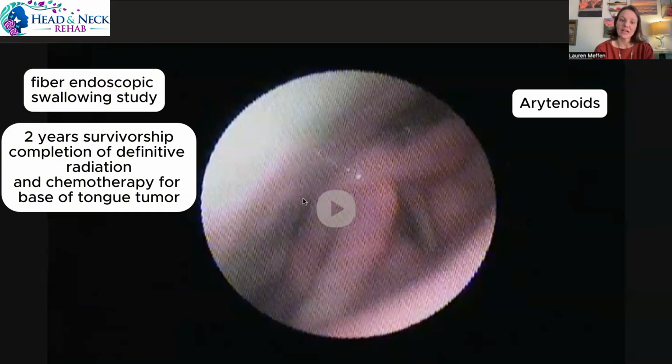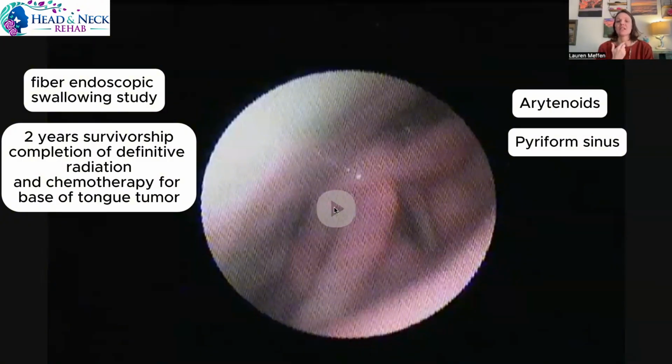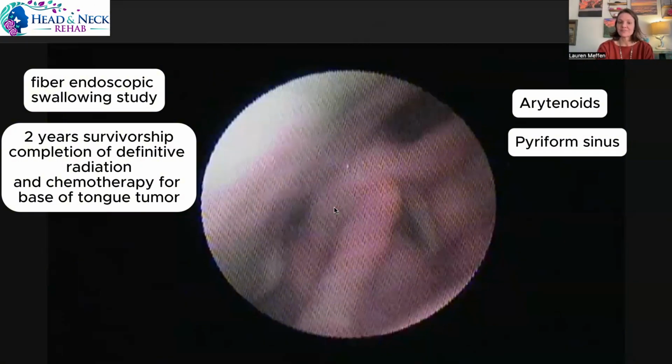And back here, I like to call these little pockets, or not just myself, but all speech pathologists love to call these pockets, piriform sinus. And you'll start to notice that there's a green tint that the patient has already been drinking, different consistencies. I'm looking to see what residue is left over in this particular patient as they are pointing to this region that is consistent with the opening of the upper esophageal sphincter or bilateral piriform sinus, or kind of a globus sensation. So we're going to go ahead and play it.